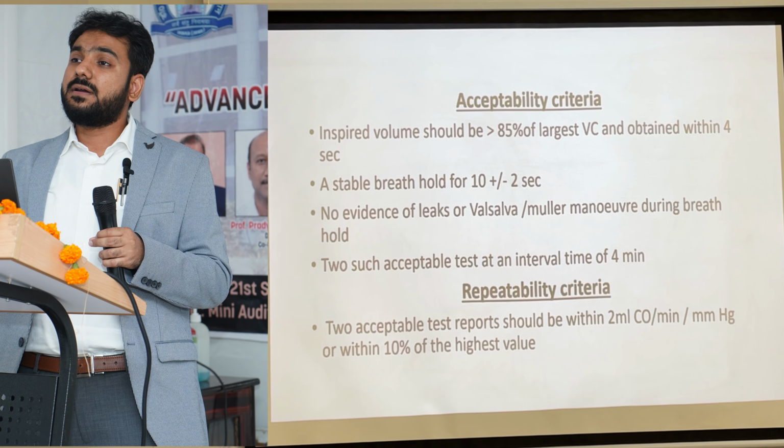What is the repeatability criteria? The 2 acceptable test reports should be within 2 ml CO per minute per mmHg or within 10% of the highest one. Okay, these are theoretical things you need to go through and you should learn them.